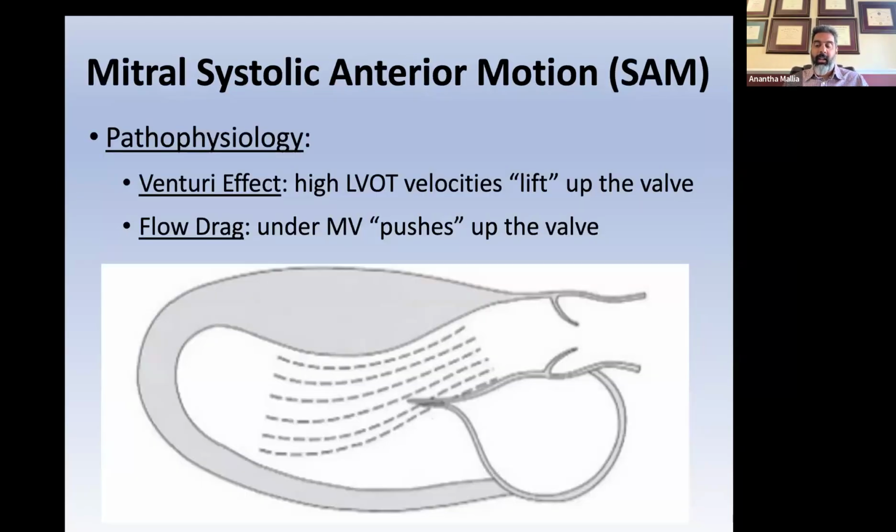But we're intensivists, right? So we're more concerned about physiology and pathophysiology. Does this patient have the pathophysiologic manifestations of HCM? Because that's what's going to be relevant to our care and to the clinical evaluation and clinical evolution of our patient. So the sine qua non finding of hypertrophic cardiomyopathy physiology is what's called systolic anterior motion of the mitral valve. What happens essentially is that the mitral valve, when it's closed in systole, moves anteriorly into the LVOT during systole.